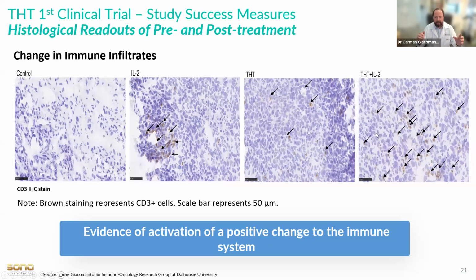And then, of course, to the right, the 4th panel, what we're seeing is if you take those immune cells and then you fire them up with a Keytruda or an IL-2 or whatever immunotherapy is on your shelf, you can invigorate those cells to recruit more cells into the fight and hopefully have a bigger effect. And so this is exactly what our immune modulation is. We're looking at panel 1 and focused on making panel 2 turn into panel 3. And so really it's the proliferation here that we're looking for, right? How widespread those brown cells effectively are.